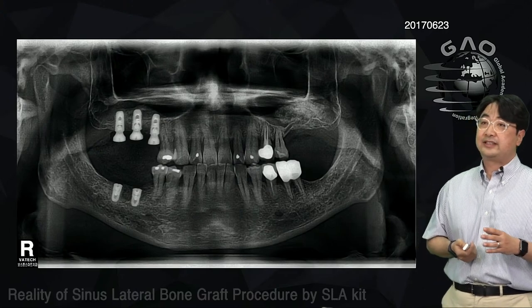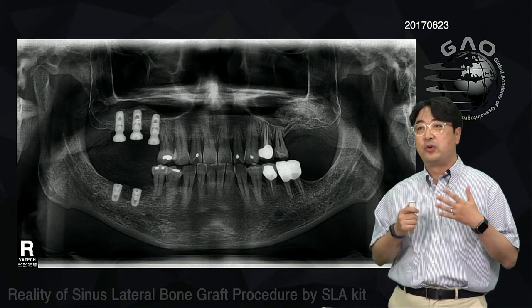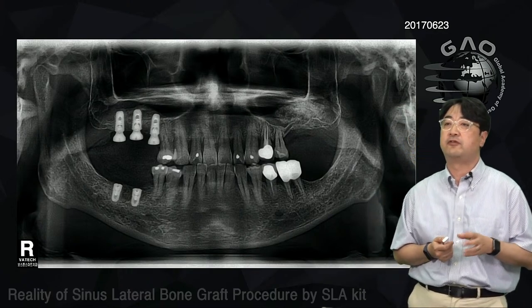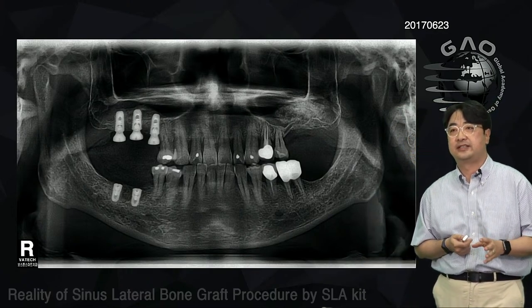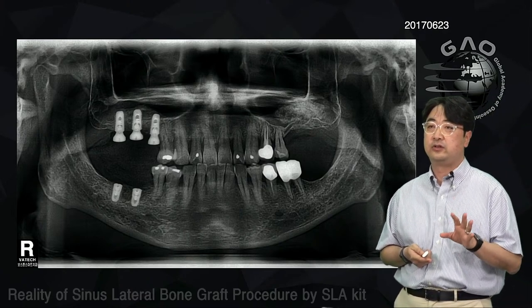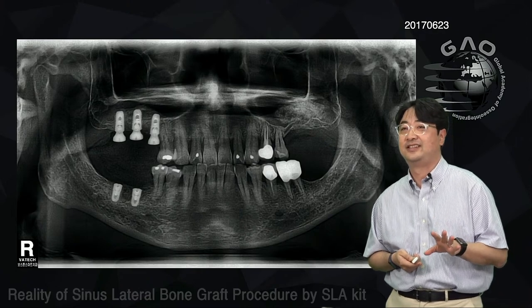Okay, so with the SLA kit, you can do most sinus grafts like this. You have to be familiar with using the freer elevator and the LS reamers. By the way, you're going to get used to it, right? Then you can do the sinus graft without stress, right?